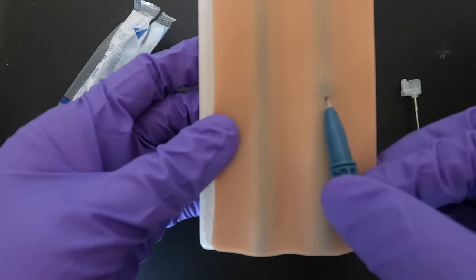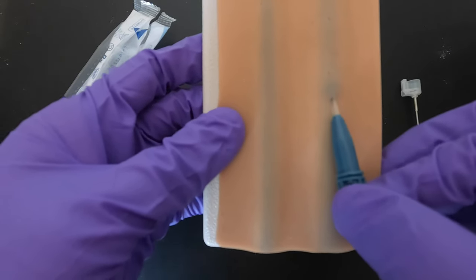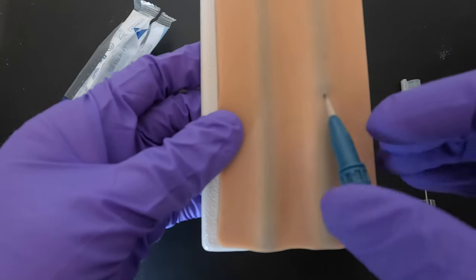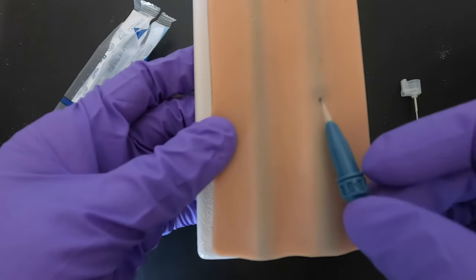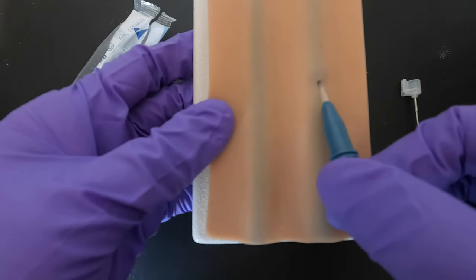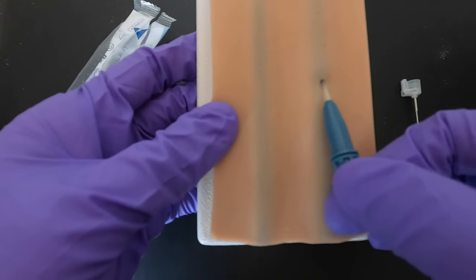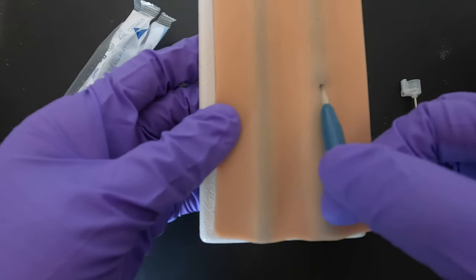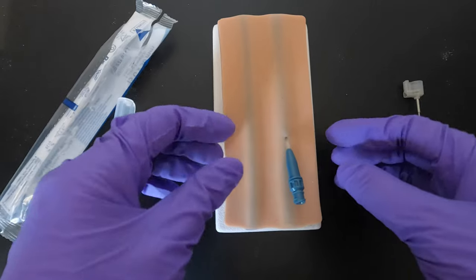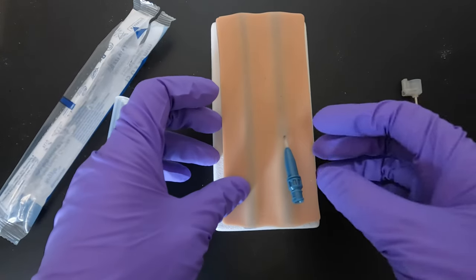Pull the sharp out completely. You don't really need to push the plastic needle all the way in — some patients prefer to have the needle out a bit. But if you can push it all the way in it's better for a good secure position. Then you'll do the taping after.